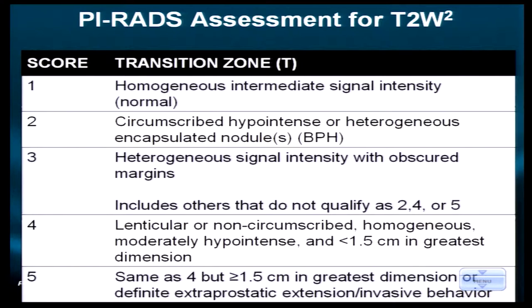If I see a nodule, and most of it is well defined, but part of it is a little ill-defined, that's when you get into the PI-RADS 3, especially if some of the other criteria are somewhat supportive. That is when you get thrown into the PI-RADS 3 no man's land designation.